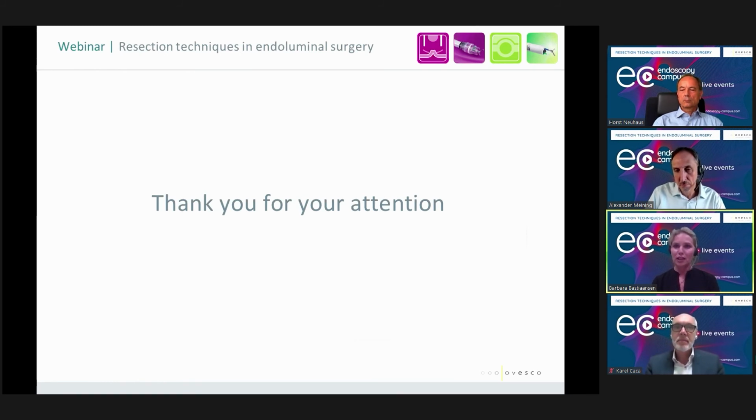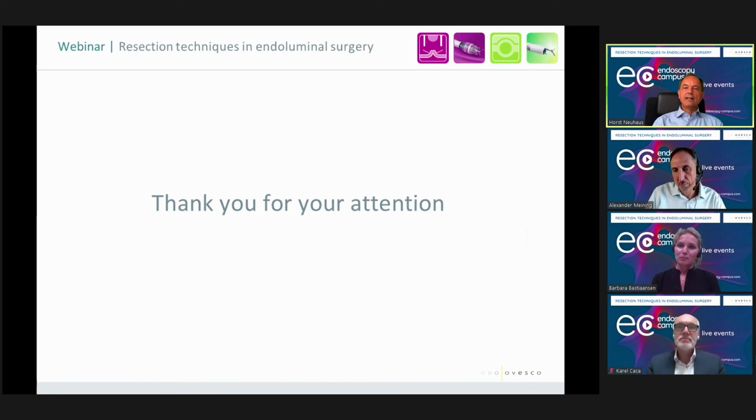So usually it's a very benign lesion, a large laterally spreading benign lesion with very often a clearly demarcated area that is malignant, and the whole area around it is benign, but that malignant area and still T1 is, I don't know your experience, but I think very rarely more than 2 centimeters. Okay, then you combine EMR with FTR, as we have heard before.